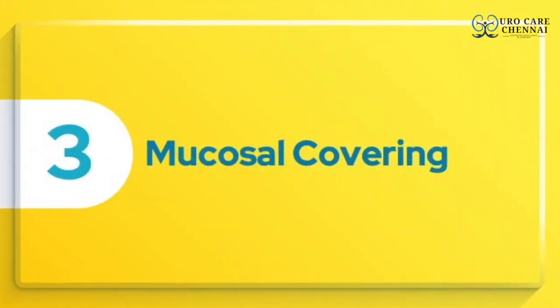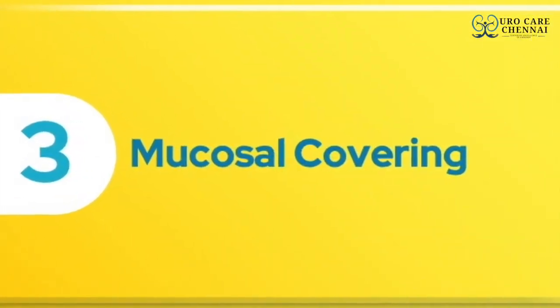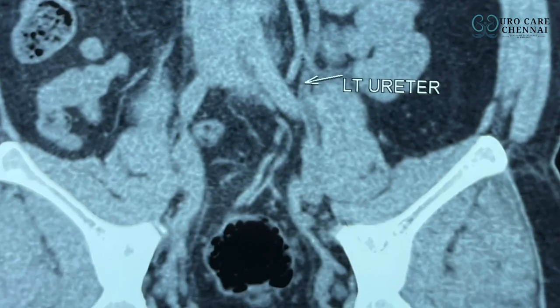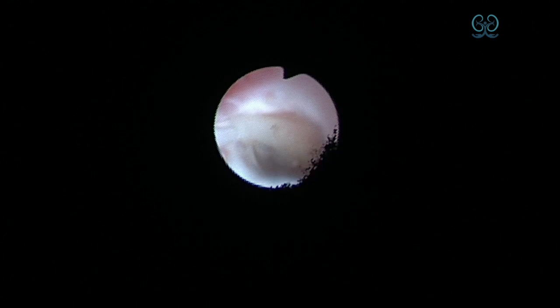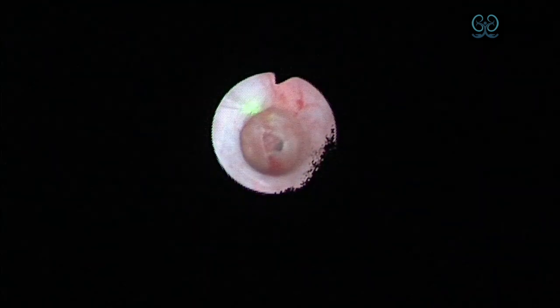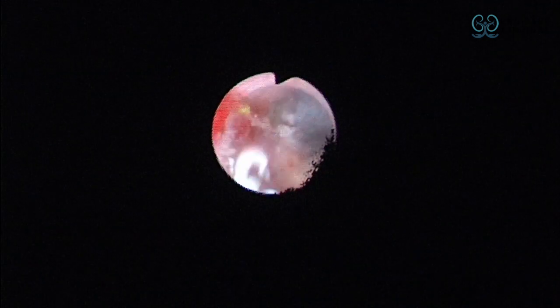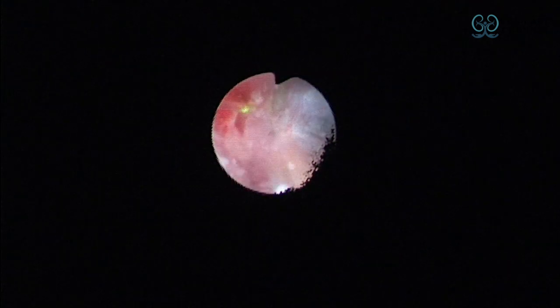Third scenario is a diverticular stone covered completely with mucosal cover. Here we can see a 9 mm middle caliceal stone. Sorry for the dots on the scope. The stone was not seen. Only a thin pale bluish membrane was seen, which we can well appreciate here.